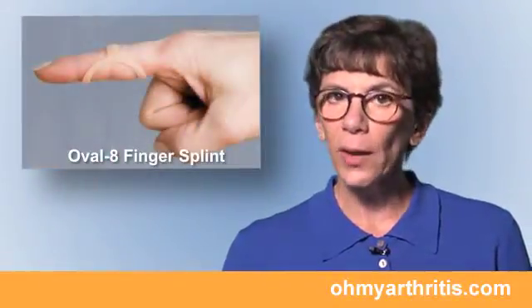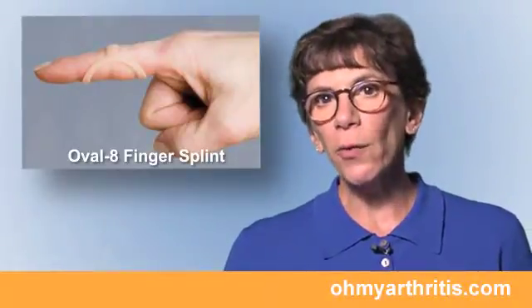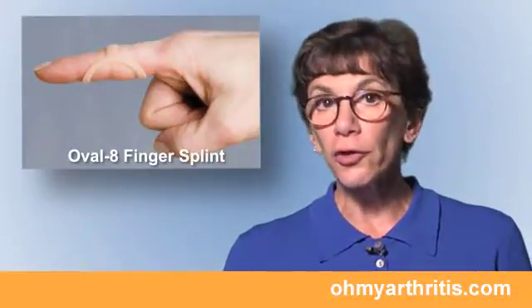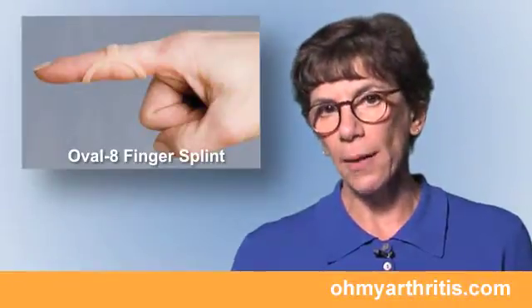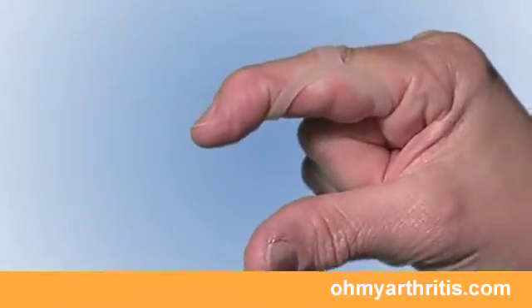Once the swelling has gone down and the finger can be pushed straight, you can be fit with a less cumbersome splint to use through the rest of the treatment time. An oval 8 finger splint is a great splinting option — it holds the PIP joint straight but allows the DIP to bend.